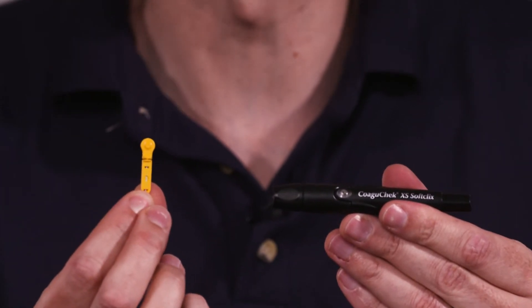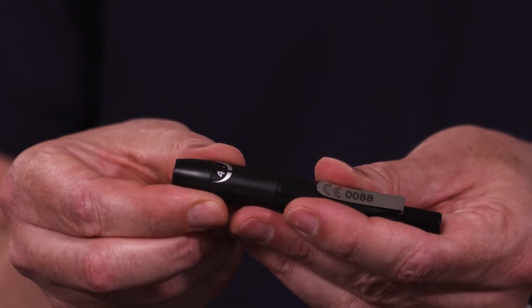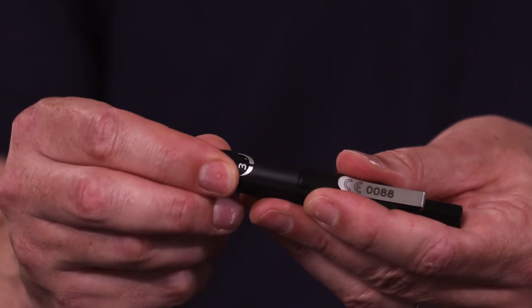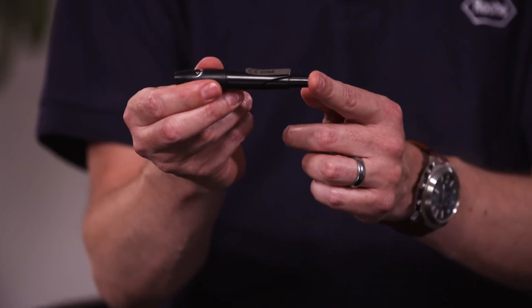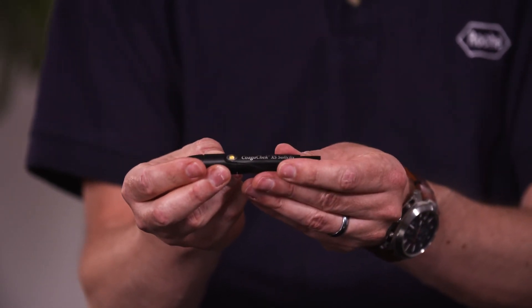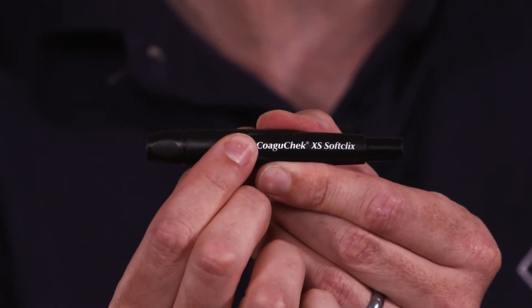Inside your package you will receive one AccuCheck SoftClicks pen and 20 single use lancets. To insert the lancet remove the cap from the end of your pen, insert the lancet into the pen and twist and remove the lid, and replace the cap. There is a dial with settings 1 to 5 for the depth of the lancet, and setting 3 is the medium setting. To prime the lancet press the button at the end of your pen. You will know that the lancet has been primed when this button is yellow.